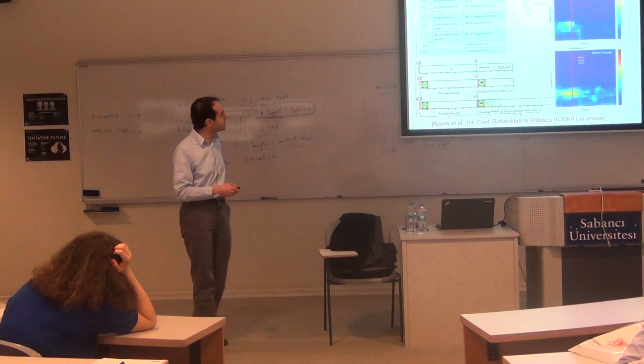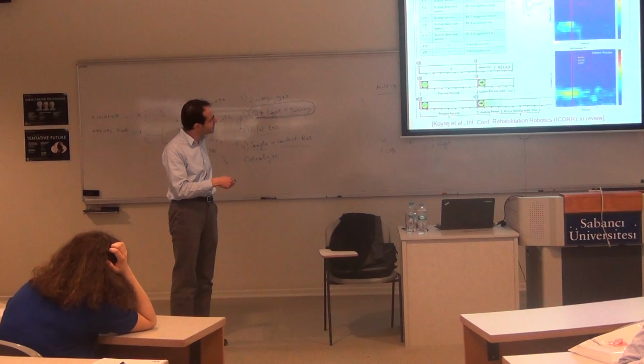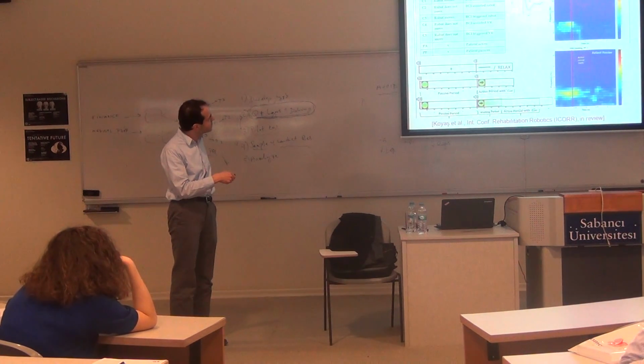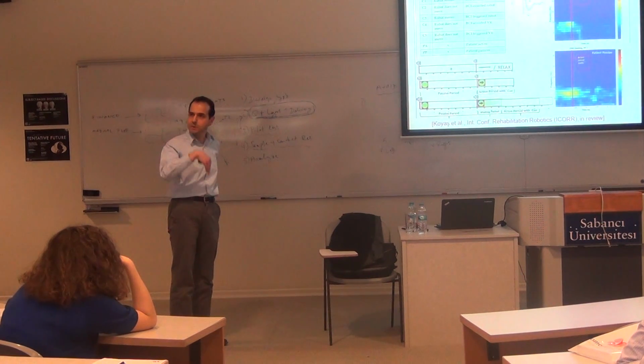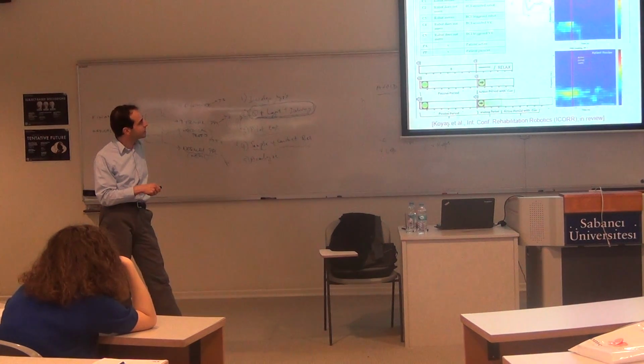What we do then is, in these two protocols, we look at the signals the subjects generate as a function of time, and especially in this frequency. We try to measure if this kind of phenomenon of suppression of signals at certain frequency bands is stronger in this protocol.